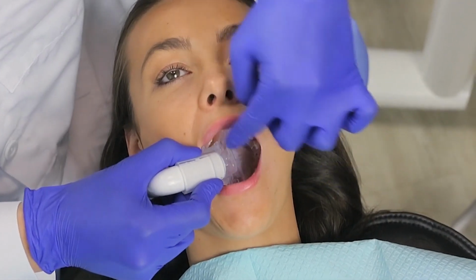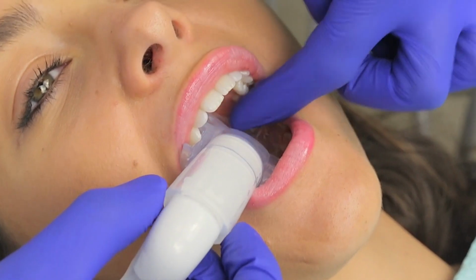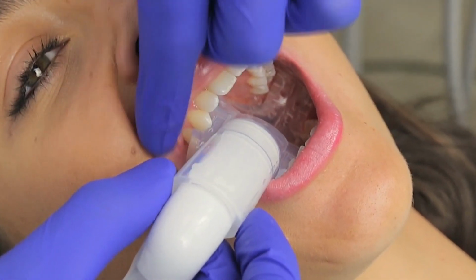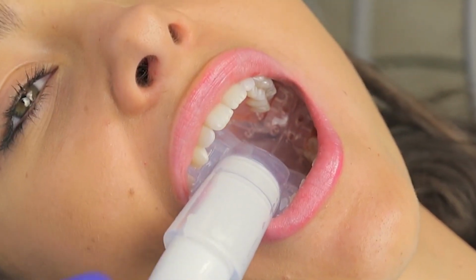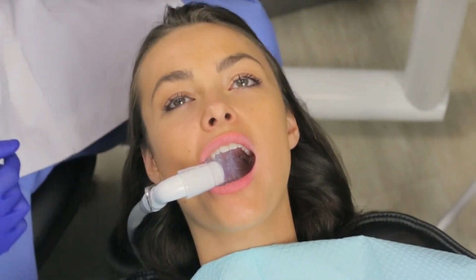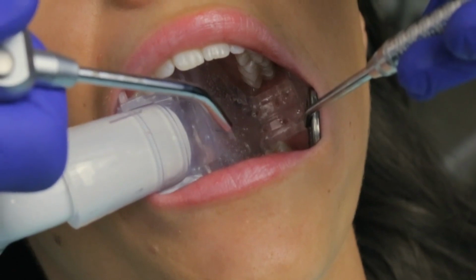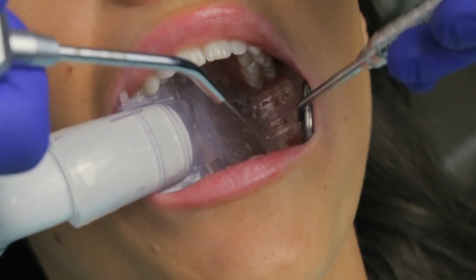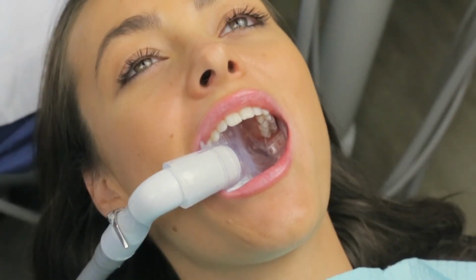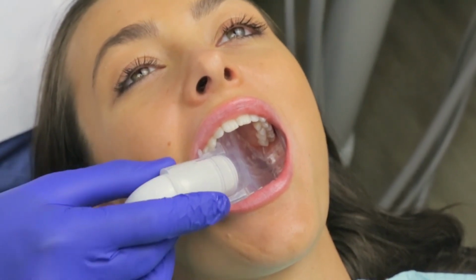Use finger pressure to adapt the cheek retractor along the inner surface of the cheek. Adapt the top of the mouthpiece to the palate and the bottom of the mouthpiece to the floor of the mouth. The narrow portion of the mouthpiece should be distal to the most posterior molar. Reposition the upper and lower lips around the corners of the bite block. You are now ready to do Dryshield dentistry. Again, don't forget to remind the patient to breathe through the nose during use of the Dryshield. When treatment is completed, have the patient open wide and gently remove the mouthpiece.